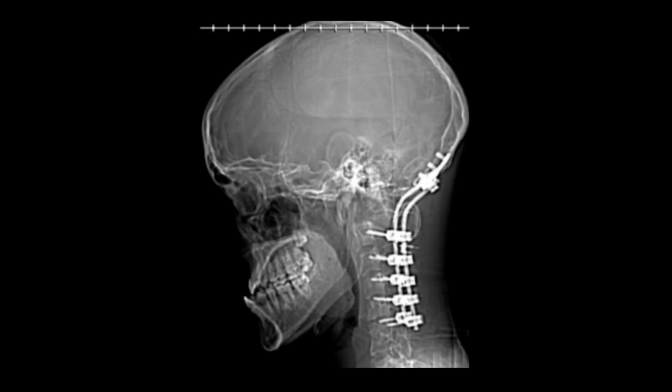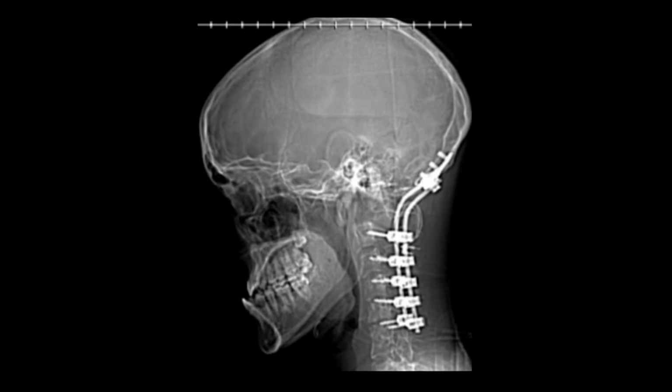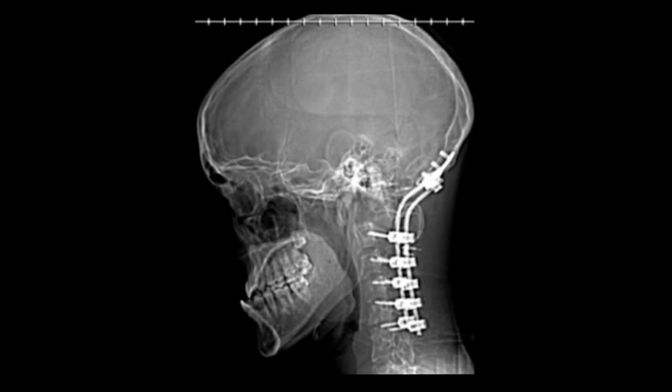Yeah, so this was a case of a teenager who had had surgery at another university hospital in another state. And afterwards, he said he couldn't swallow. Now, he'd had an anterior decompression done, and then they did an occipital cervical fixation in the back of the neck. He presented to me for a second opinion before getting another operation, and I realized that they had tucked his chin in too much. And so I said, I think all you need is for us to take out everything that they've done and realign your neck so that it's more upright, and I think you should be able to swallow pretty well.